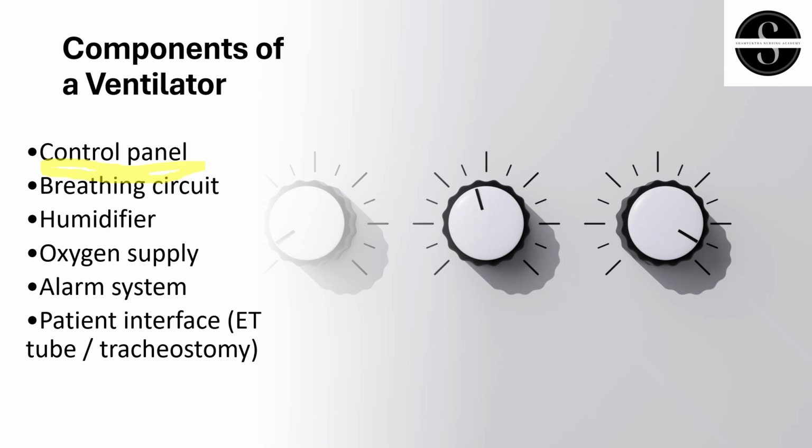Tidal volume, minute volume, rate and all those things, where all the settings will be present in the ventilator is called the control panel. Next is what? Breathing circuit. What is breathing circuit? The circuit which is coming from the patient bedside.